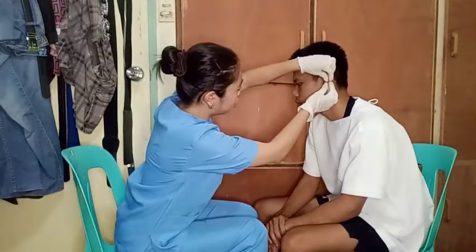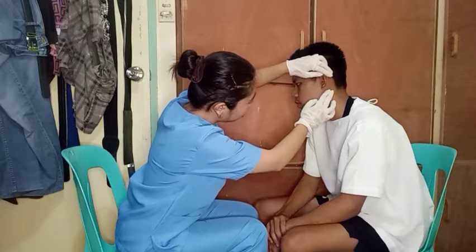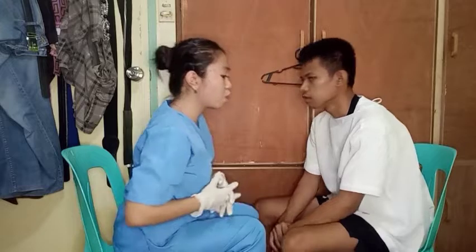The other side, sir. Okay, the mastoid. Okay, sir, it looks like there is no tenderness on that ear, and no swelling. So, the second part of the assessment is the otoscope examination.